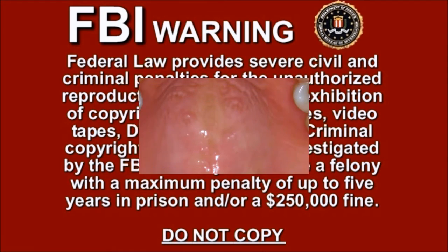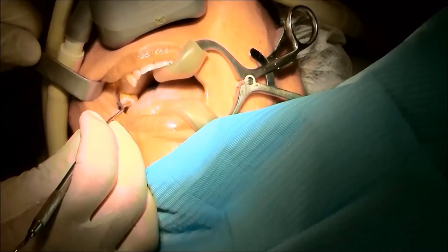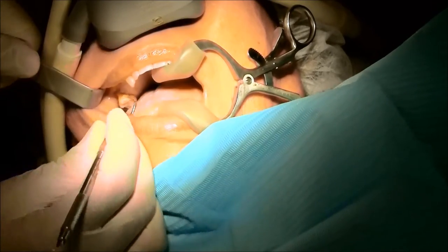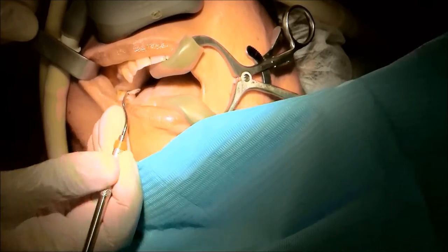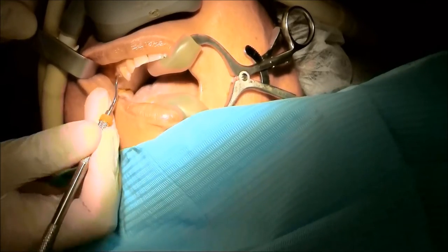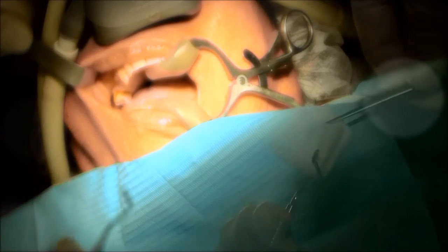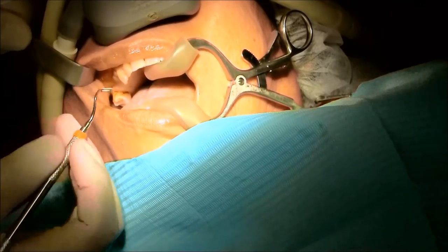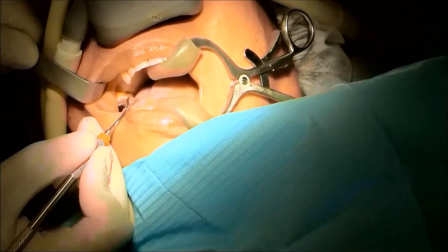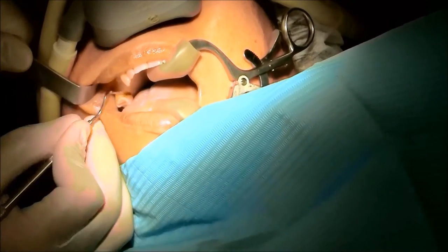Hello, this is Dr. Ferris Erezek and I'd like to make some comments on this surgical procedure. We have more tissue and we're going to use two Noble Active implants. We started here by just preparing the surgical site and we're doing some scaling on the adjacent teeth. I want to make sure that we don't have any biofilm, tartar, or plaque next to the surgical site.